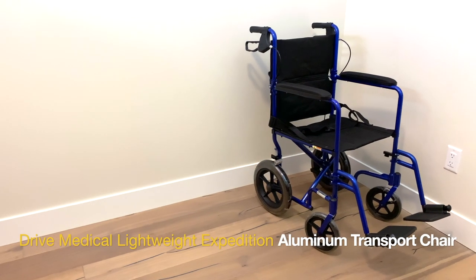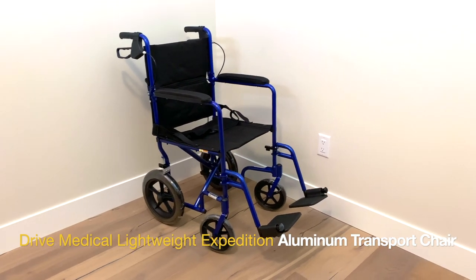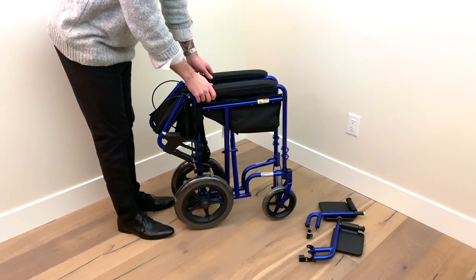The Drive Medical Lightweight Expedition Aluminum Transport Chair is a premium transport chair that is easy to use and collapsible. Let's go over how to set it up.